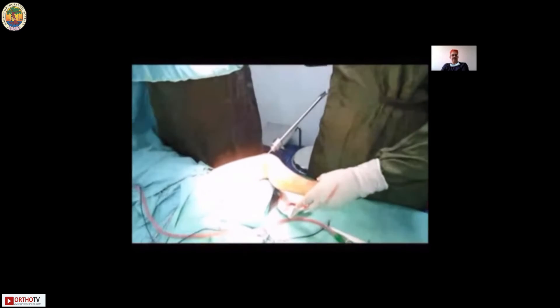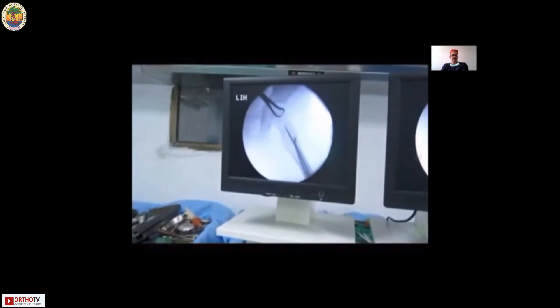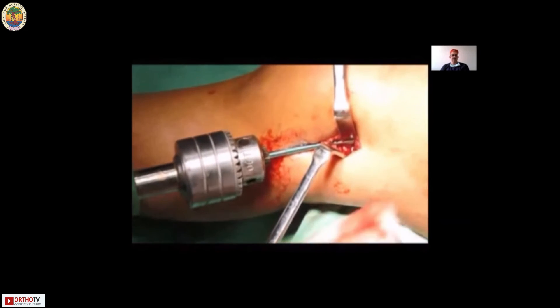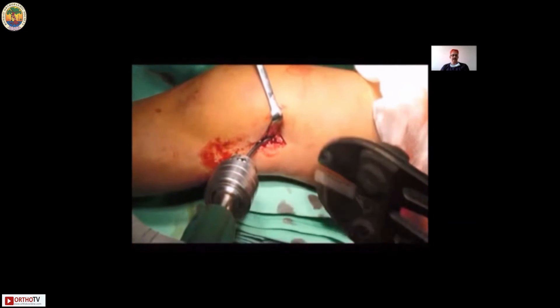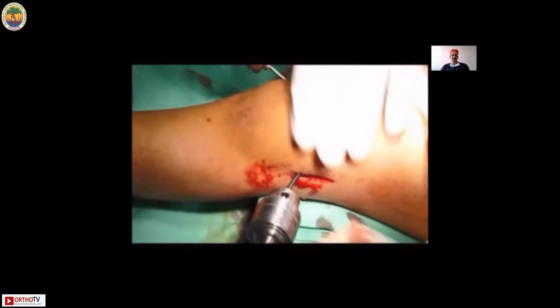Confirm the reduction and placement. The medial nail can go up to the neck because more metaphyseal bone is available there, and the spindle has completely formed at the apex where we expect it to be. Always check the lateral view so that you know the fracture is well aligned and stable in both views. Make sure your nail seating is in the metaphysis and has not penetrated the physeal plate. That's the gentle final seating.